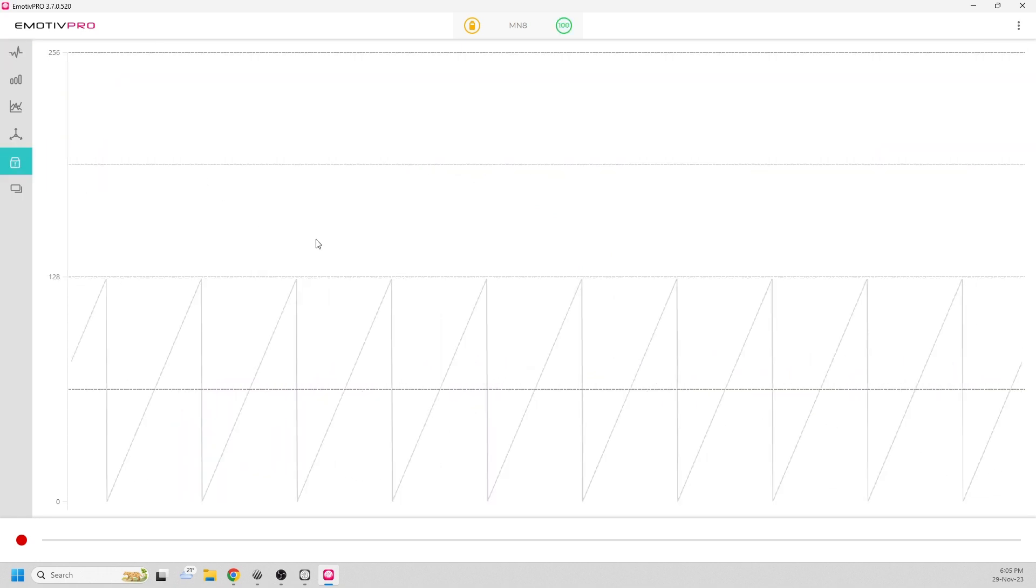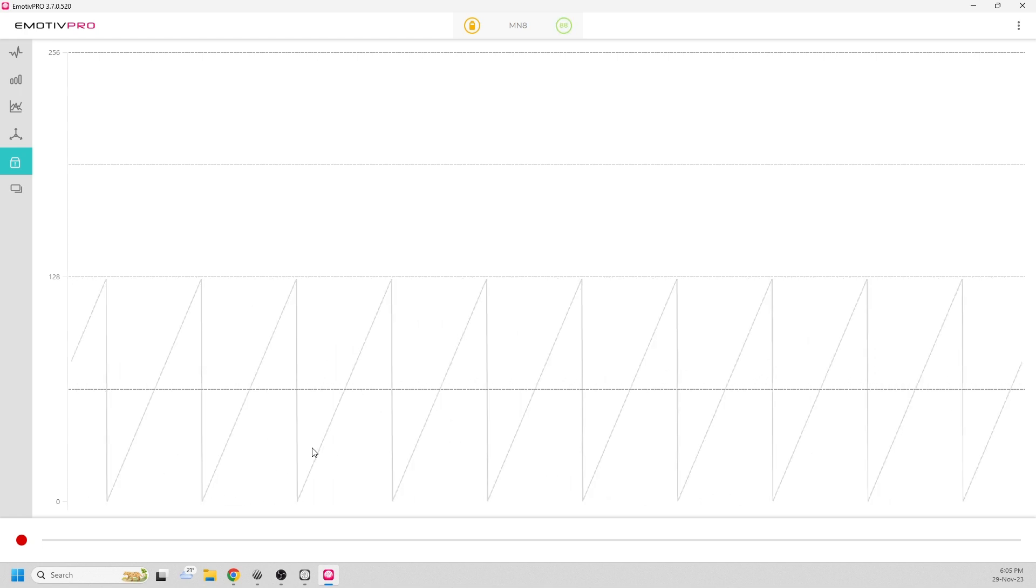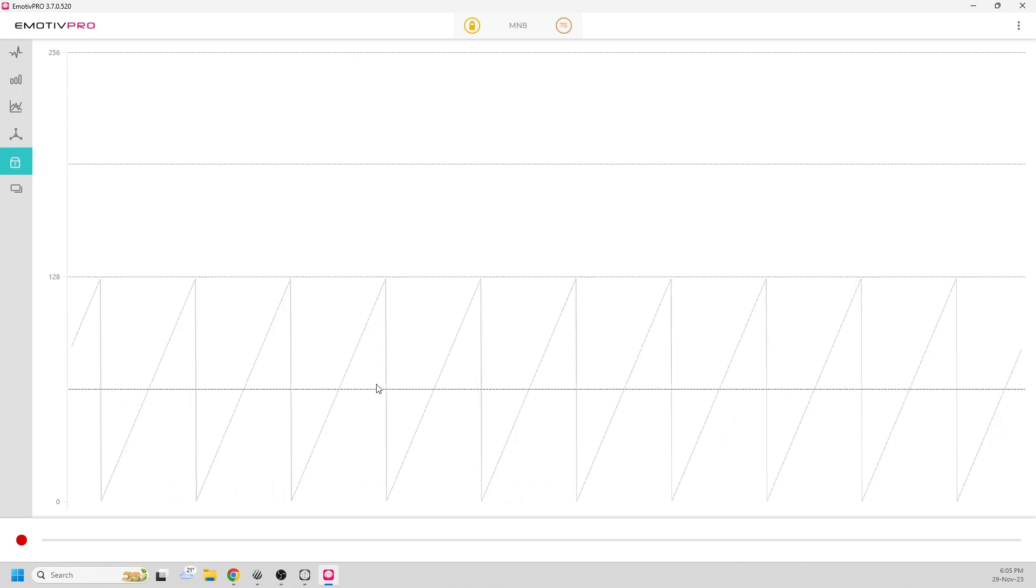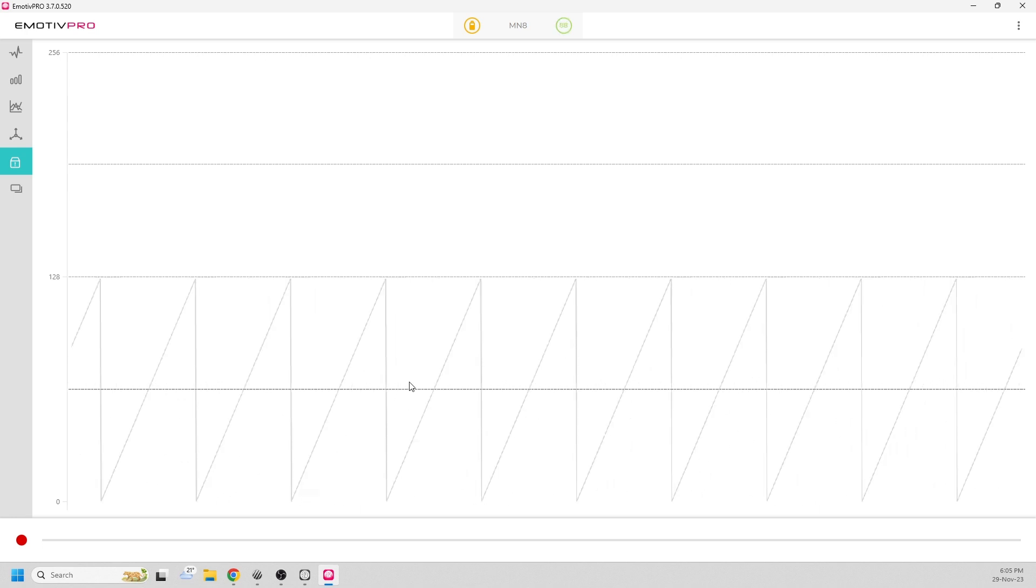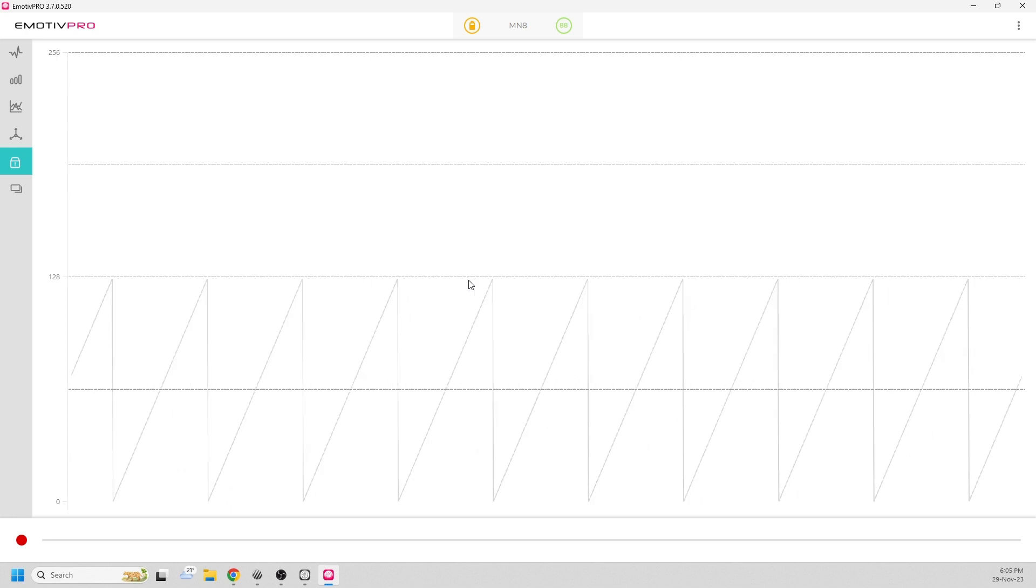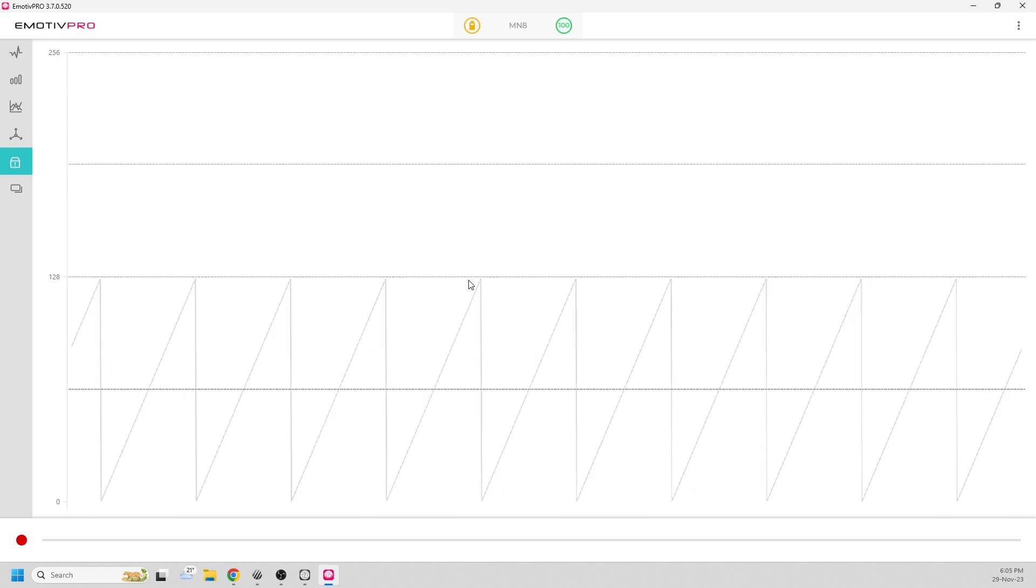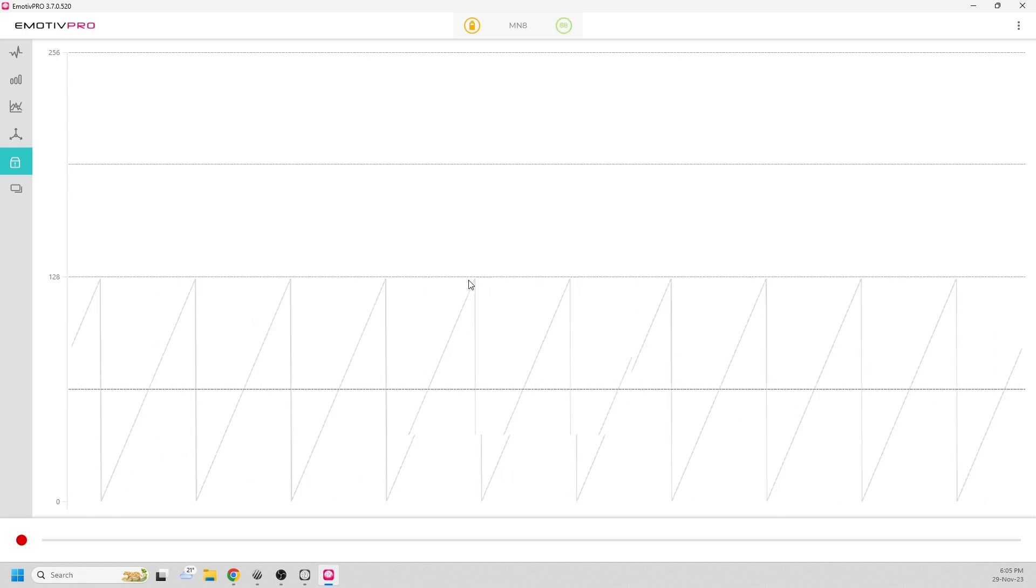We should also check the data packets tab to make sure we see this nice sawtooth pattern and that you don't see large red vertical lines that indicate data packet loss. If you do see them, you need to make sure you move away from any devices that may be causing noise.